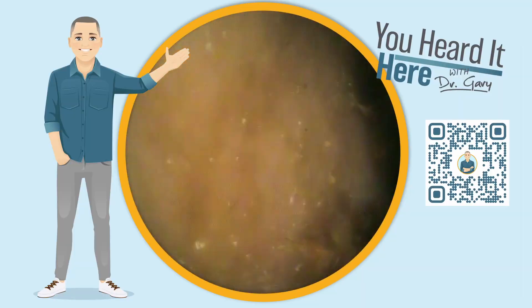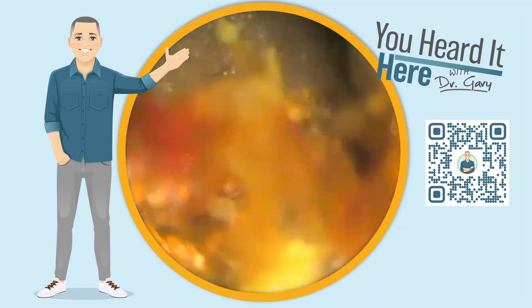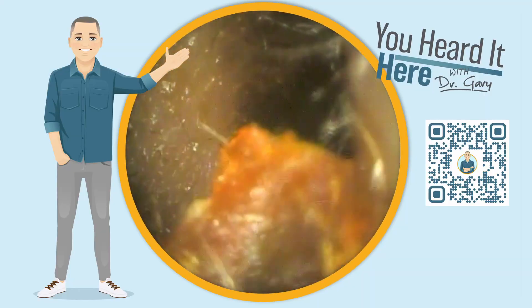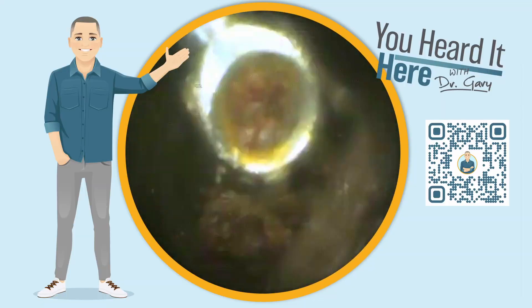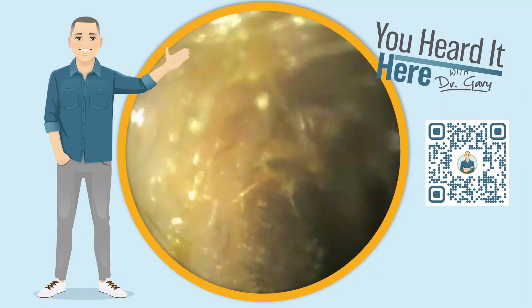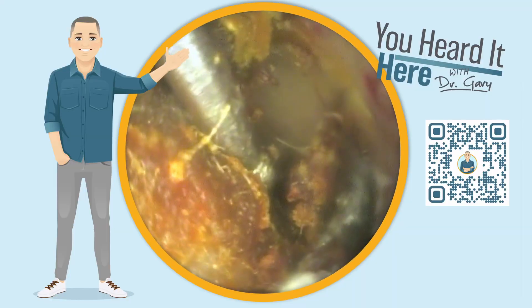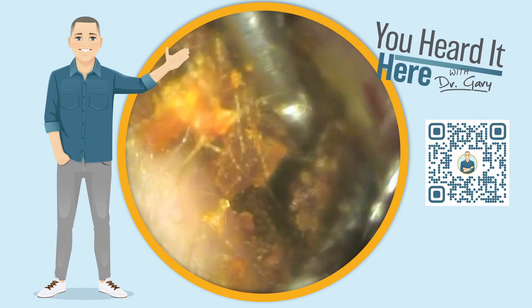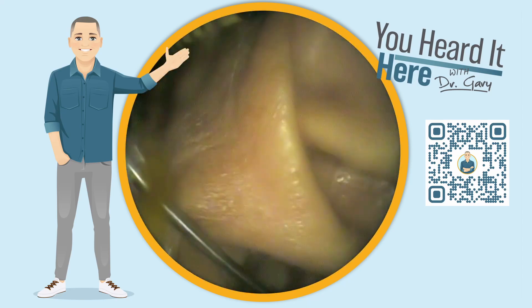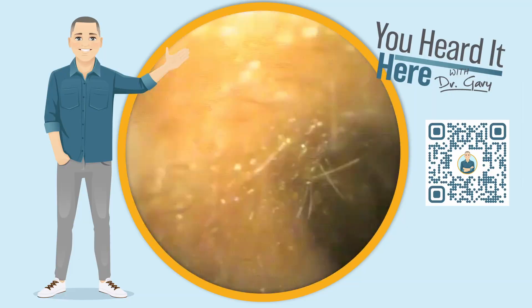We did talk to this patient about being referred out for micro suction. They declined — they've had micro suction in the past, approximately a year and a half before this appointment, and decided they didn't want to go that route again because the noise gave them a headache and they didn't find it comfortable. That's up to you as a patient. Micro suction, irrigation, or manual tools are all very appropriate ways to remove earwax when done carefully by someone who knows what they're doing.